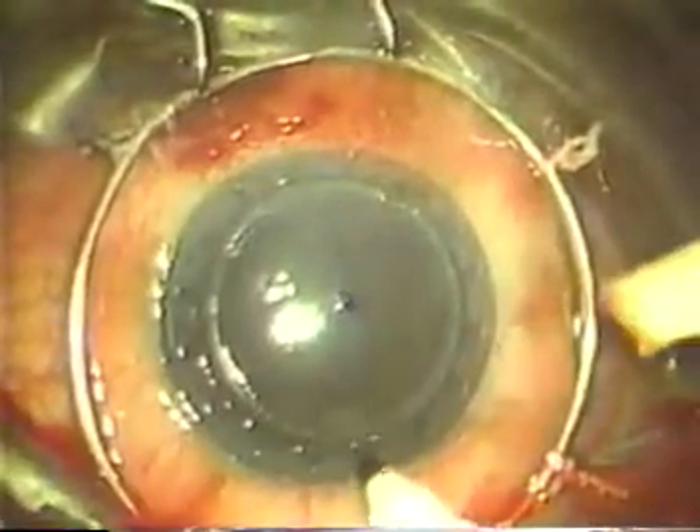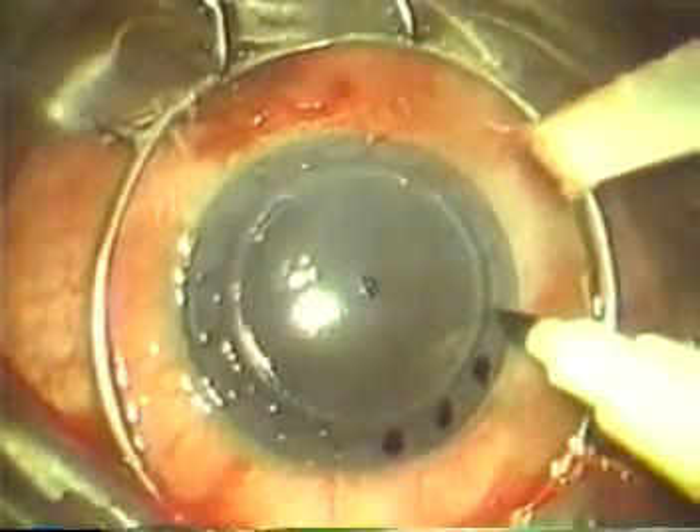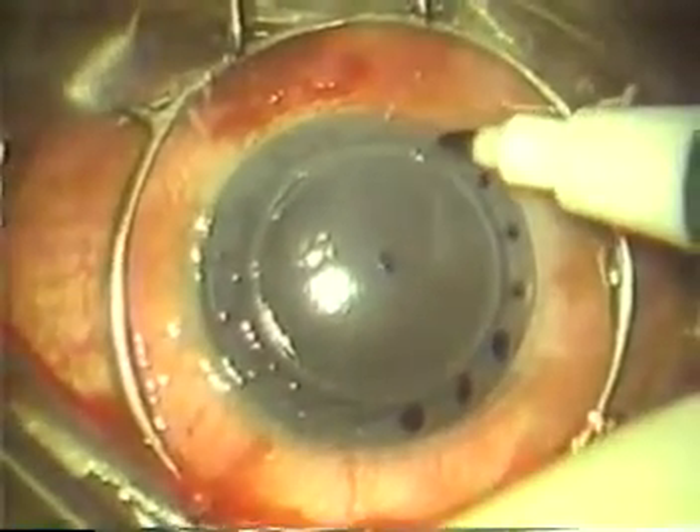The anterior surface of the recipient cornea is then dried to reveal the 16 radial impressions made by the trephine, and each impression is marked with a surgical marking pin containing gentian violet ink.